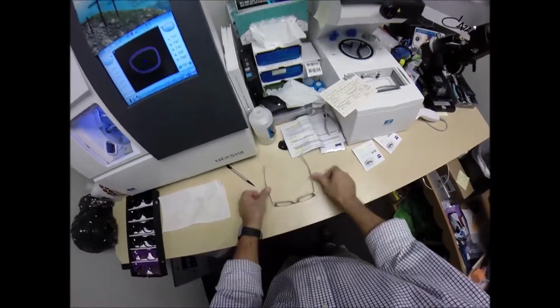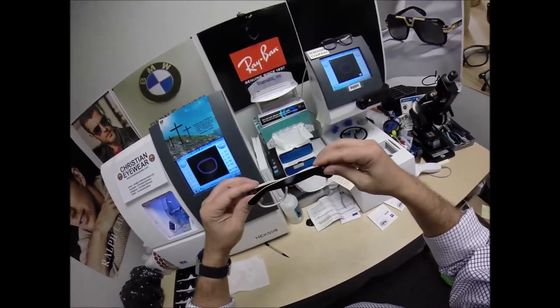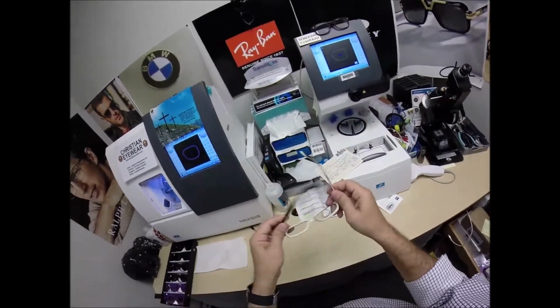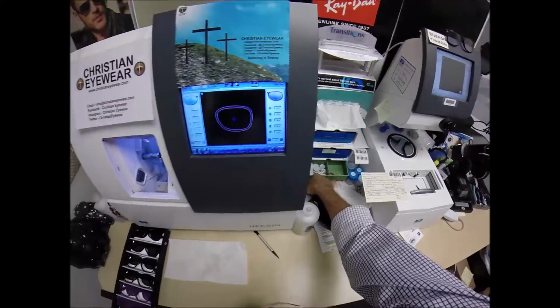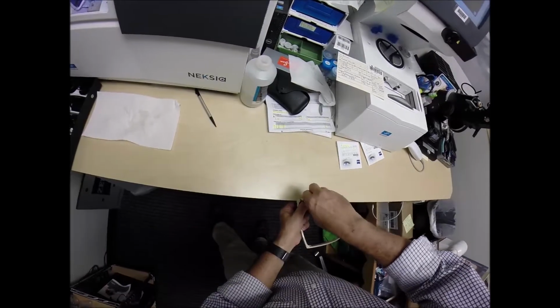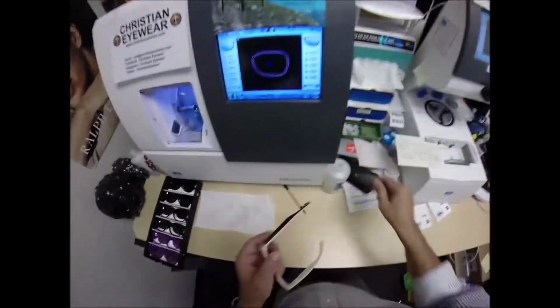Flip it over, press down, there is no wobble. Close each temple to make sure they overlap perfectly, and they do, that neither temple is askew. Check the tension on each hinge. This one feels a little bit looser, so let me get my screwdriver, do a little bit of righty-tighty. Yeah, that's the same now.